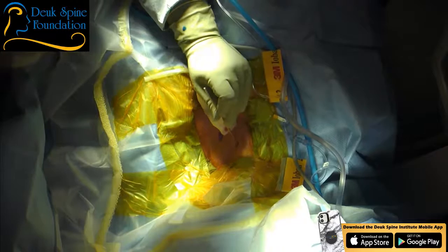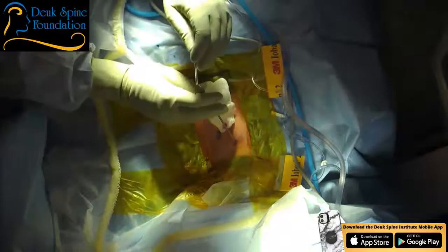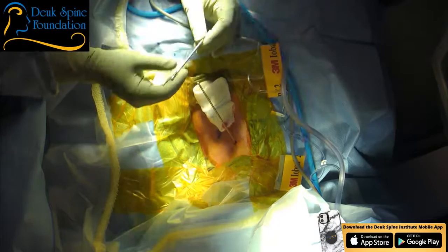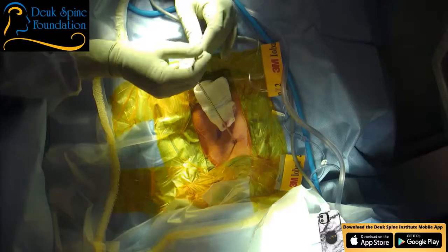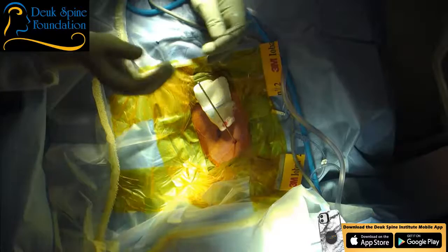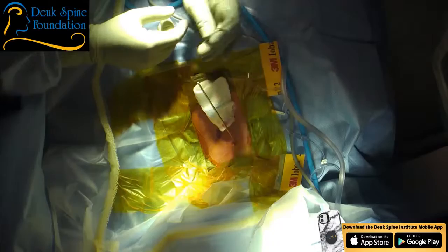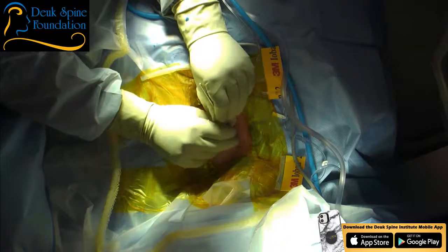The tip of that thing is right in the herniation — the base of the herniation — and it's going across the disc to the right side. The entire surgery is done with a tiny little metal tube called a tubular dilator. Very commonly used in surgery. You can see it in my hands — it is small. So here's one of the advantages: it is literally the smallest surgical incision that can be made to remove a herniated disc in the neck. There's nothing smaller. So I'm going to put this tubular retractor over the dilator and run it down so the end is right where the herniation is. That's what I'm going to remove — just the herniation.